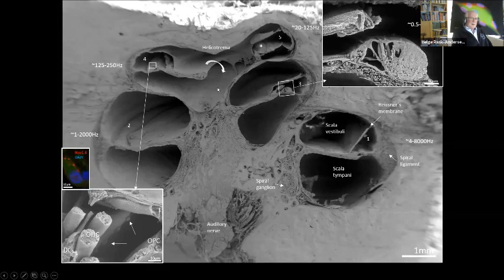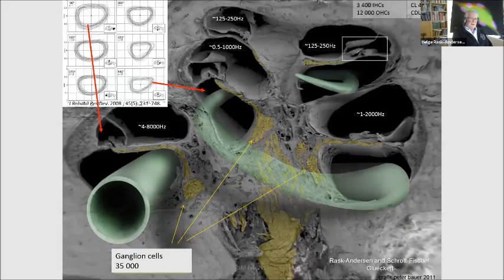Here you see the cochlear implantation involves basically these spaces of the human cochlea, not the apical third turn. There are 3 turns, as you all know, in the human cochlea. And what we will see is that the spiral ganglion is only 2 turns, which is very essential when it comes to cochlear implantation. And of course, we try to put the electrode in the scala tympani, very atraumatic, and we can see the different sizes of the scala tympani in different turns.